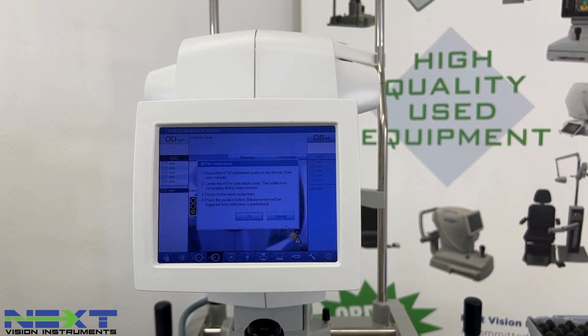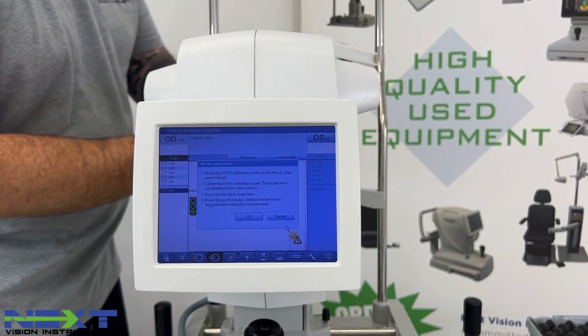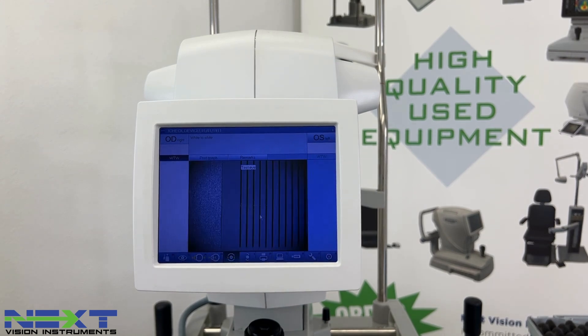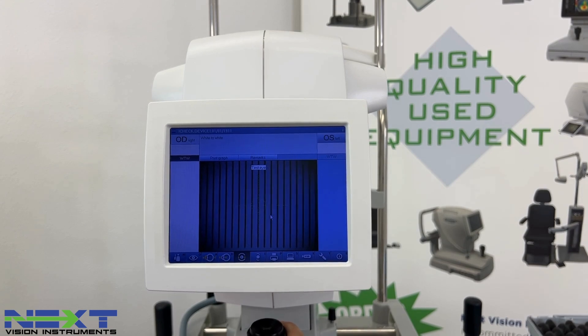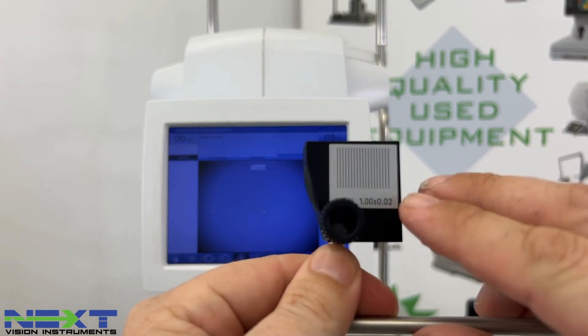Next is the white-to-white measurement. The screen tells you to mount the calibration scale on the device, center the white-to-white calibration scale so it completely fills the video window, focus the black scale lines, and then press the joystick button for the measurement. Go back to the test eye and flip it around to the opposite side from the anterior chamber depth — these are the black lines it's referring to. You want to fill the entire window with those black lines, then push it in or out to get those lines as clear as you can, and click the joystick.